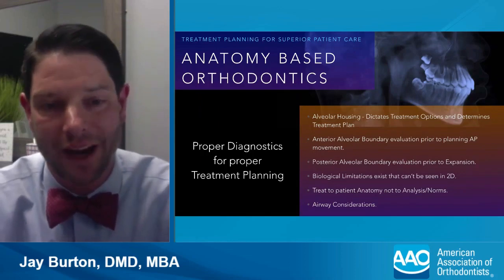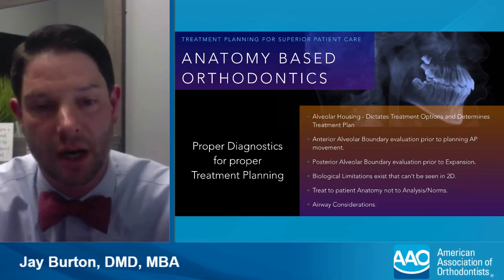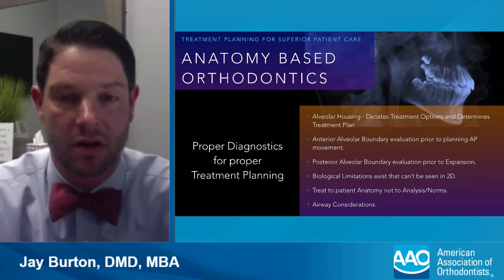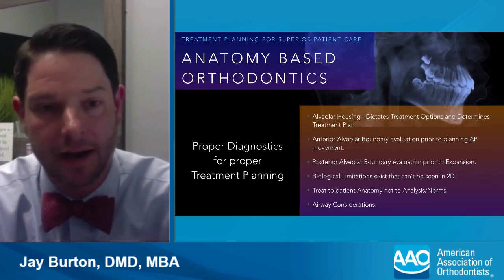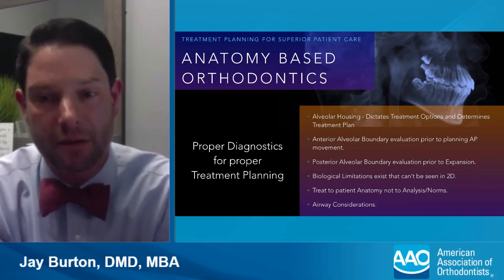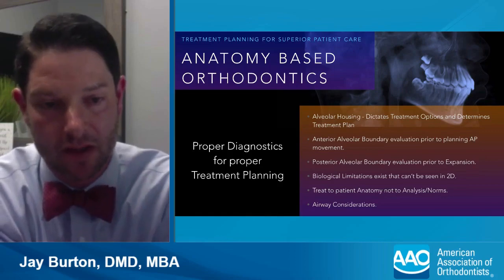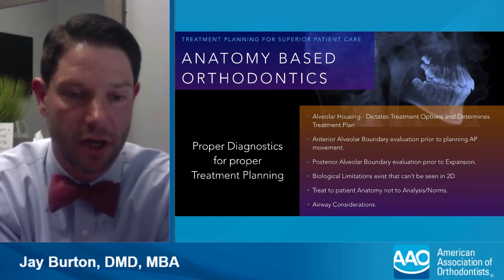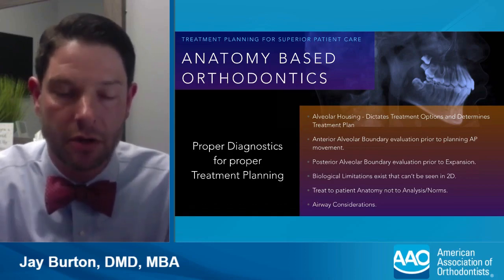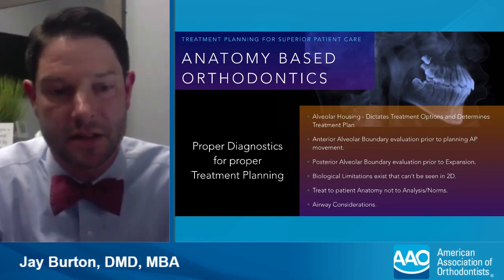It allows you to look at the alveolar housing, which in my practice, in my hands, dictates the treatment options and determines the treatment plan way more than a ceph or a pan ever could. Because it's ultimately that anterior alveolar boundary that allows me to make the decision on how much I can either retract or procline lower incisors, whether bone is there to do so. It's looking at the posterior alveolar boundary and evaluating that prior to placing an expander or determining which type of expander needs to be placed.